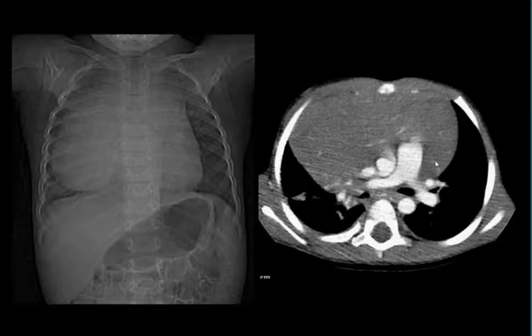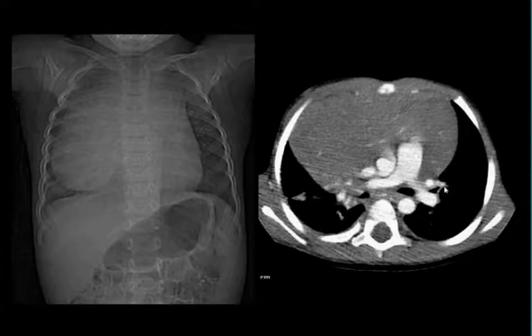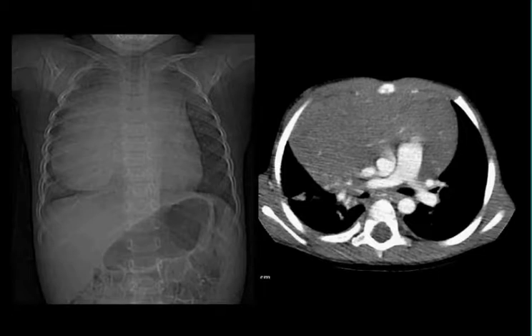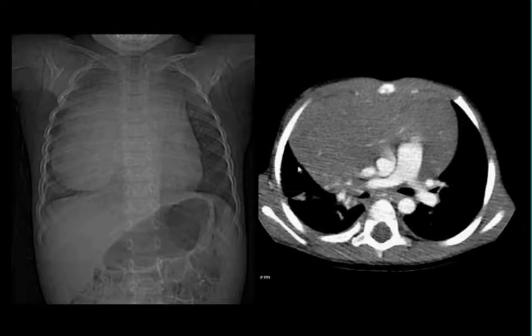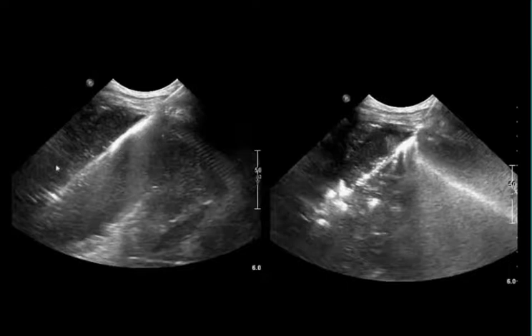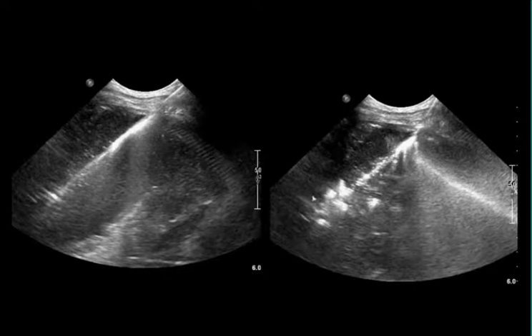For an osteogenic sarcoma patient with a small nodule, the surgeon needed to take it out. We placed a Hawkins localization needle through it and injected blood around it so surgeons could see where it was in the pleural space — much easier than just a needle, which often gets pulled out when the lung is deflated intraoperatively. Another patient had a huge mediastinal mass we were asked to biopsy. We prefer not to take these patients to the OR because of anesthesia-associated mortality risk with large mediastinal masses. Using ultrasound — no radiation, real-time visualization — the mass came right up against the anterior chest wall, giving us excellent access. After biopsy we injected gel foam to prevent bleeding. This was a lymphoma; we got everything needed for diagnosis without opening the chest.